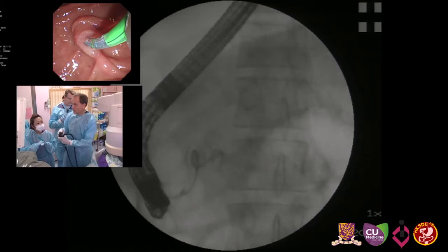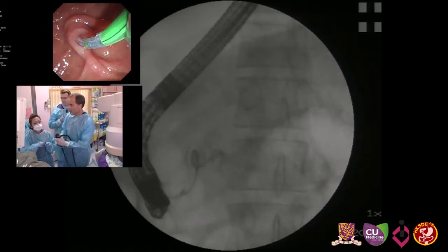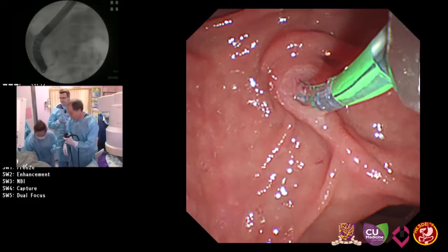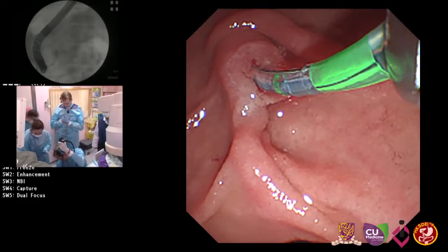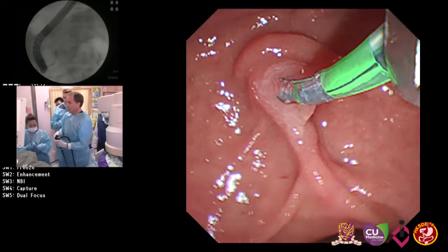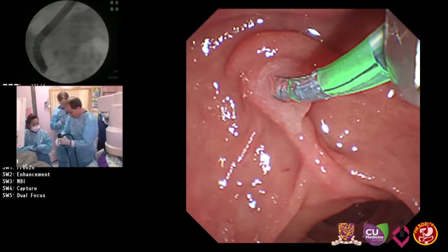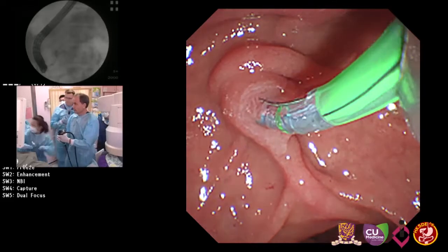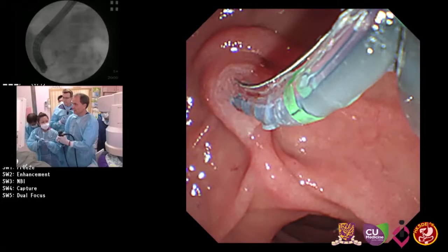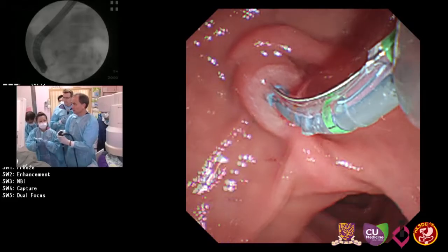So we will now do pancreatic sphincterotomy. Then we have more space to maneuver. And for this purpose, I switch off the endocut function. So this is now pure cut. And so push the wire a little bit forward to keep access. And now bend the sphincterotome a little bit.